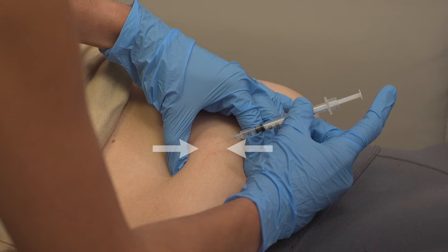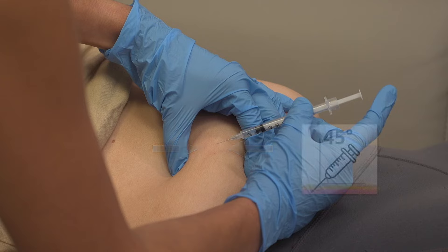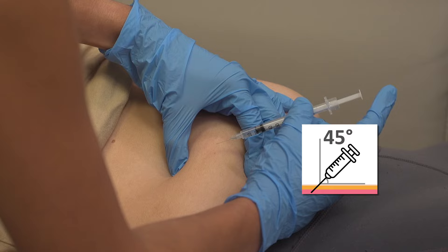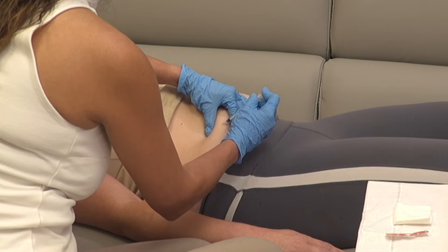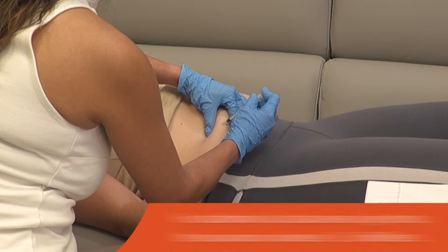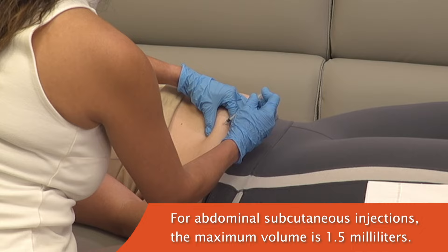Continue holding the pinch during the injection — this helps the medication go into the subcutaneous tissue and not the deeper muscle. Be careful not to insert the needle too quickly or deep, and be mindful of your fingers that are pinching the skin. Insert the needle at a 45-degree angle into the pinched skin with a dart-like movement of the wrist. The needle should be completely covered by skin once inserted. Press the plunger all the way down smoothly to administer the medication. The maximum recommended volume for abdominal subcutaneous injections is 1.5 milliliters.